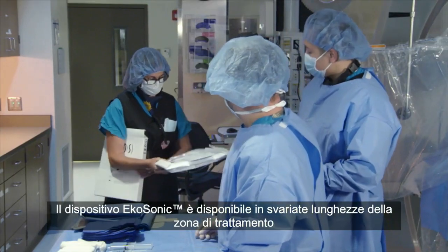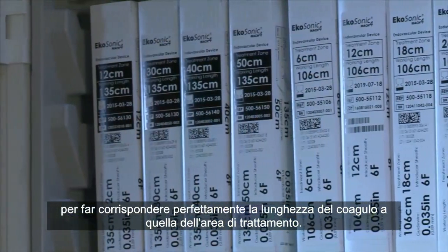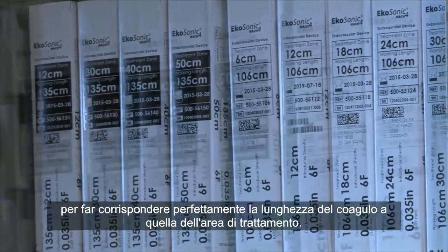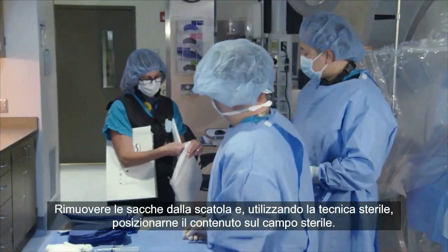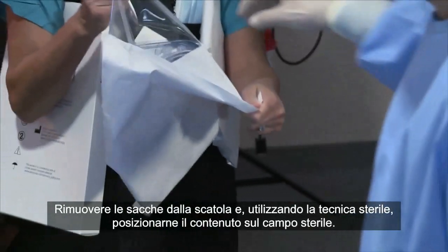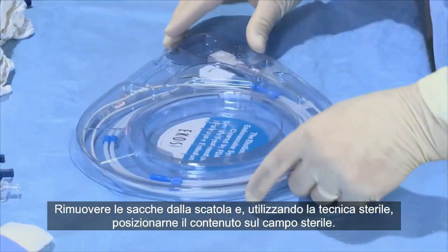The EKOSonic device is available in a variety of treatment zone lengths to precisely match the length of the clot to the length of the treatment zone. Select the device with the appropriate working length and treatment zone. Remove the pouches from the box and, using sterile technique, place the contents onto the sterile field.